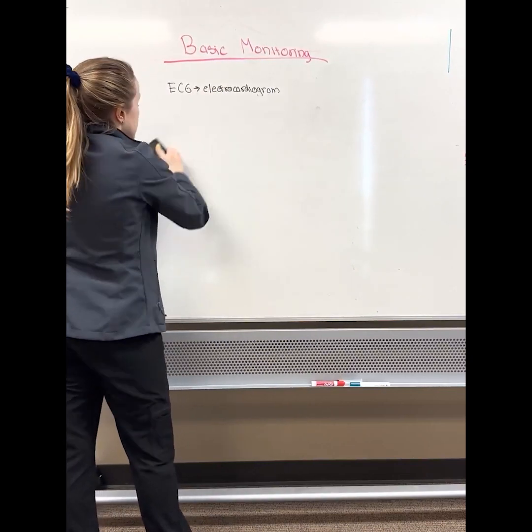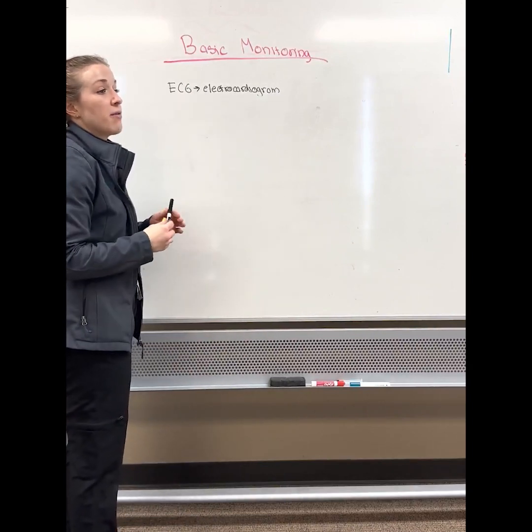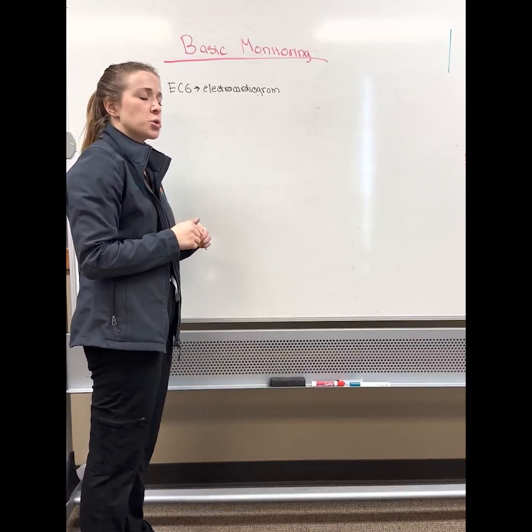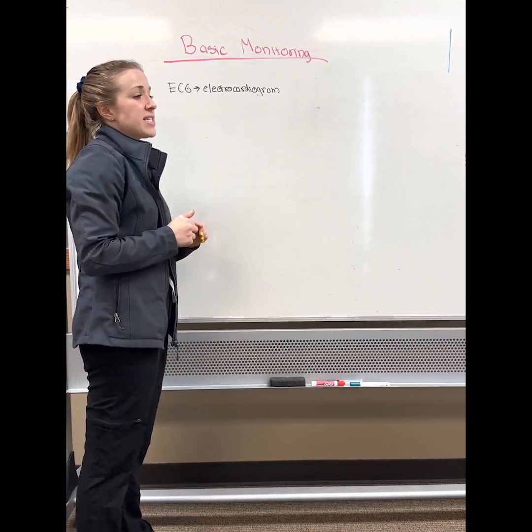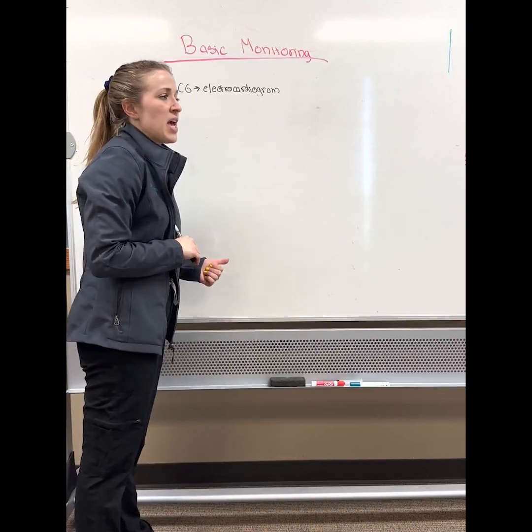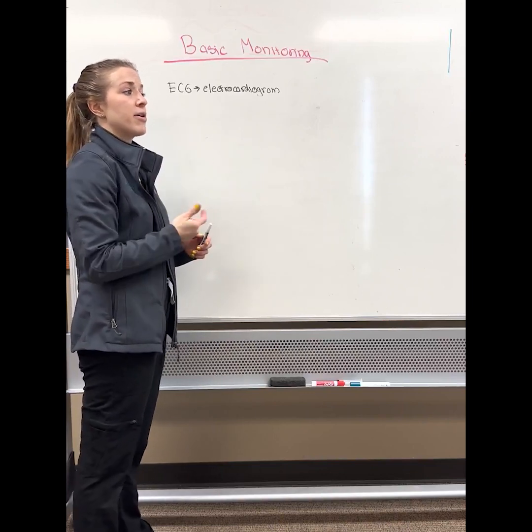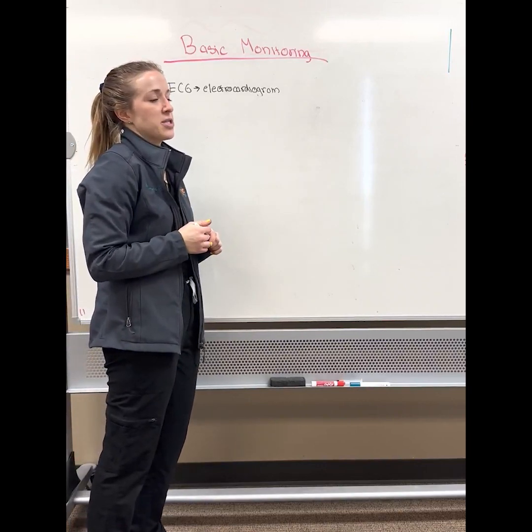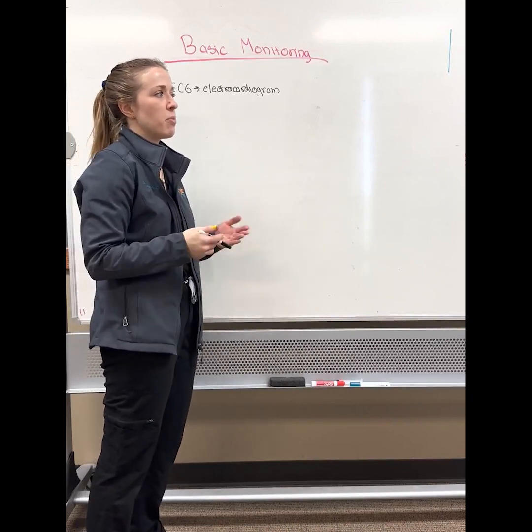Now, the ECG can tell you about heart rate, and it can tell you about heart rhythm. Depending on the appearance of the PQRST, you might also be able to tell about certain types of chamber enlargement or diseases that the animal has. So that's one reason why it might be important. The ECG can tell you about anesthetic depth, so if they're light or really, really deep. It can tell you about pain or nociception, so if they're really uncomfortable, they might get a little tachycardic, right, or have a bit of a response. And the ECG can also tell you about fluid or volume status. Animals that are really dehydrated might get tachycardic, so sometimes those animals benefit from a fluid bolus.